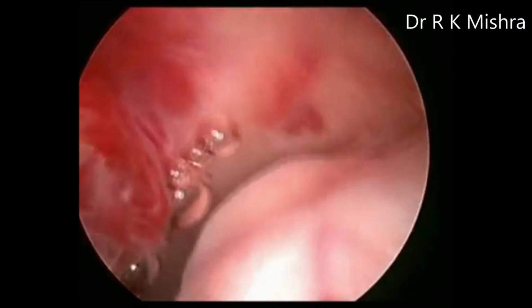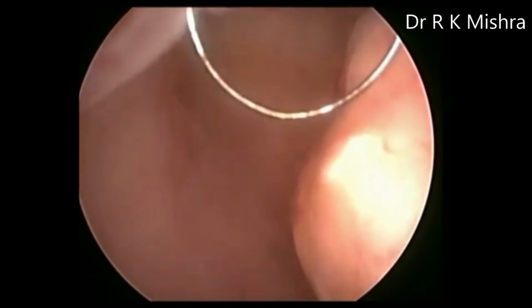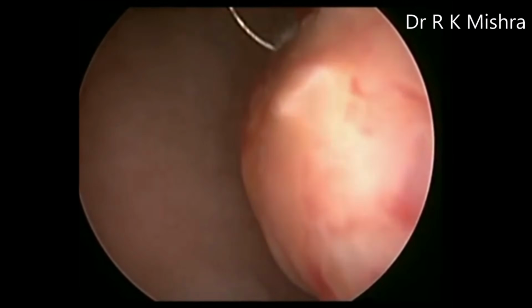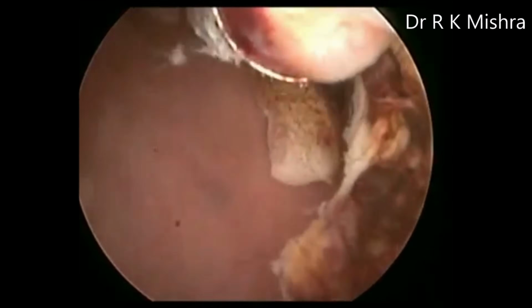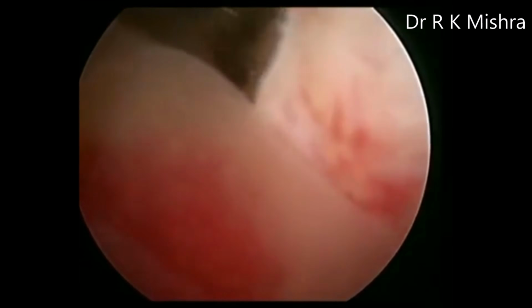So this is the loop electrode, and slowly you have to go towards the dark and then come to bright. So here you will hook, look and cook. You will go all the way, and then slowly you will start resecting the submucous myoma. During resection, you should try that a small chip is taken, and the wattage we use is approximately 120 watt.